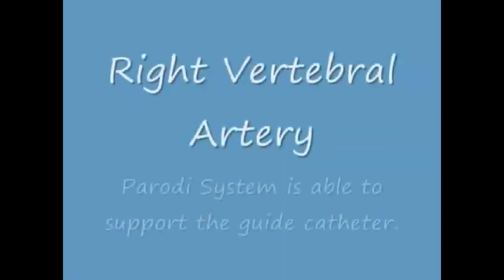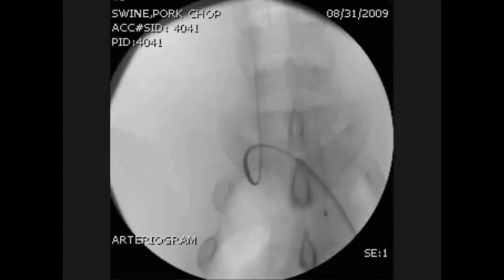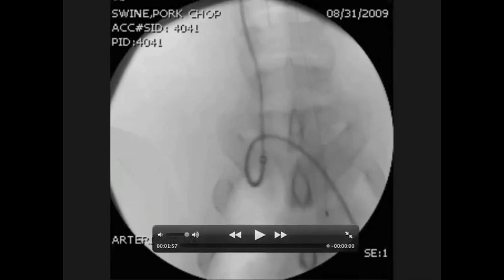This is an example of a right vertebral artery that we could not navigate with a regular glide wire, and now we are using this particular device. As you can see, we can track through very tortuous anatomy with no problem.